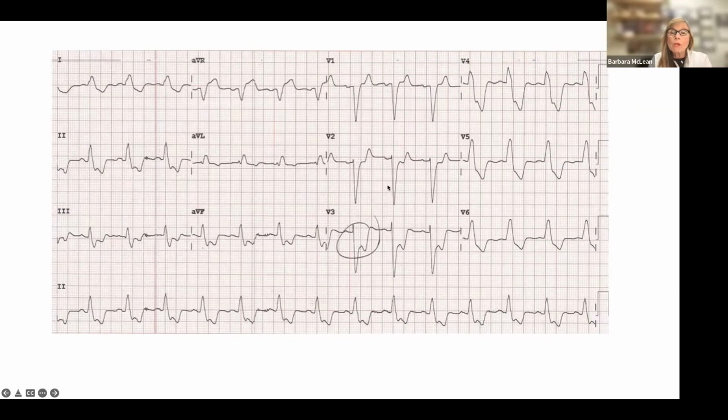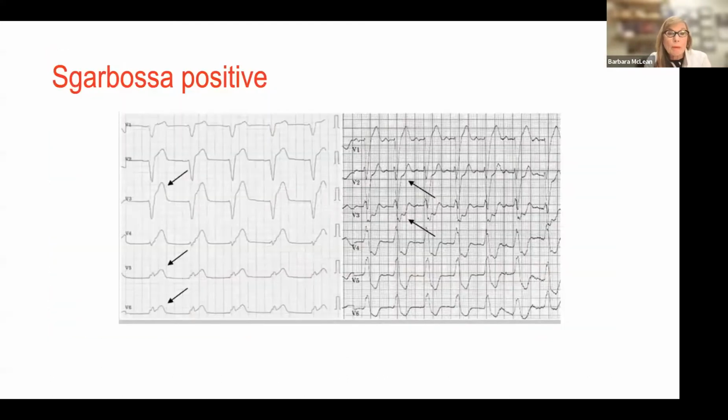Look how you're downwards here, and you have ST segment depression. This is called concordance. This is a STEMI. This is actually an inferior posterior STEMI. Okay. Yes, you have bundle branch block, but you expect on the right side of the heart to see discordant ST segments, meaning ST segments should be up when the QRS is downwards, and they're not. They're concordant. Concordance is a problem.